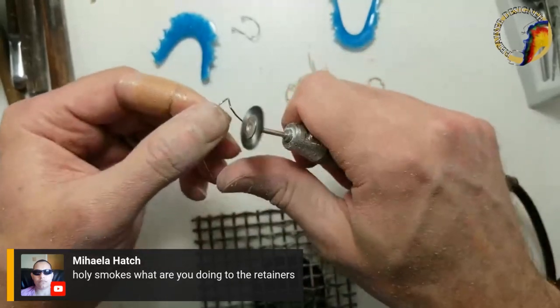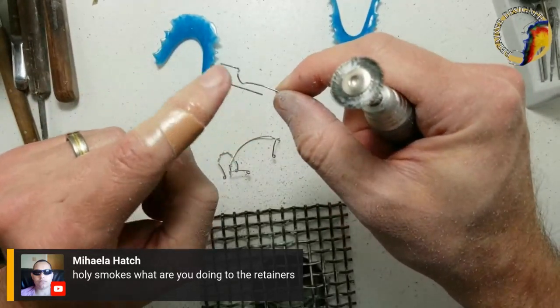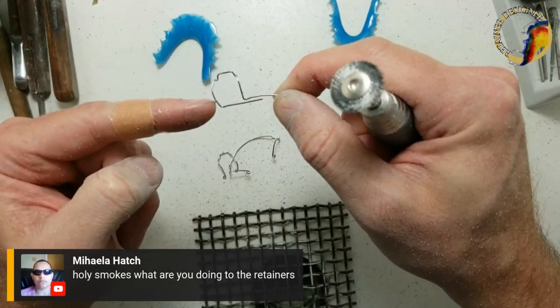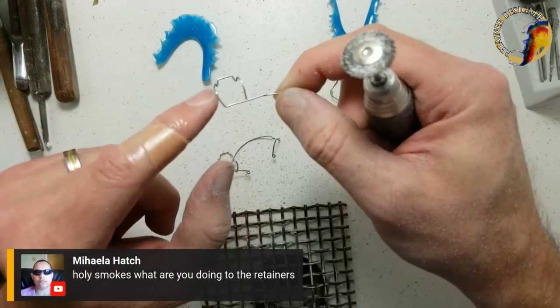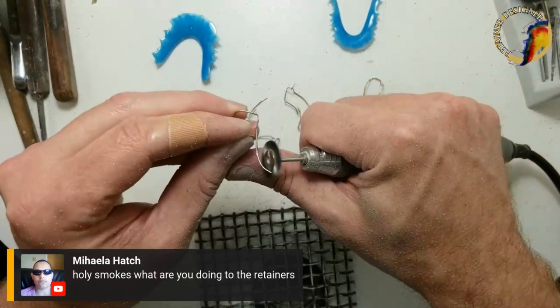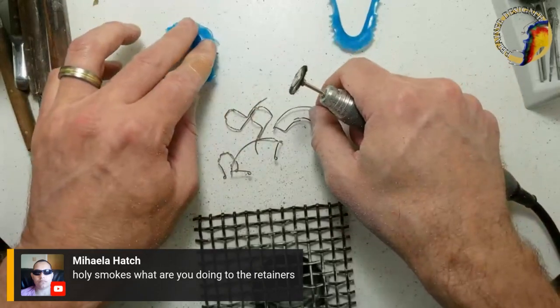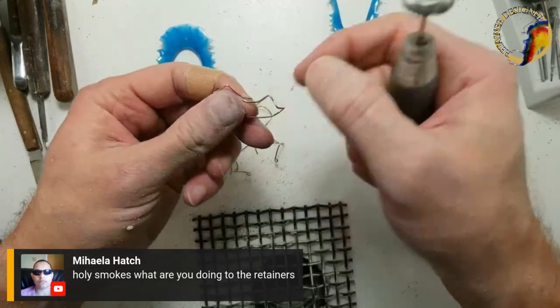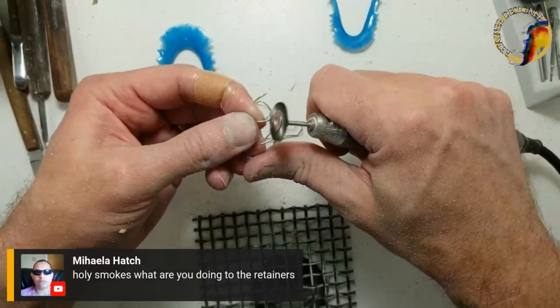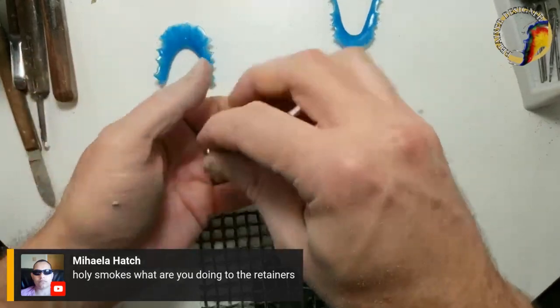No wires were hurt in the filming of this video. I'm just cleaning this up. You can see this is a little off — that's where the Adams clasp was adjusted, which put pressure. When I took it out of the acrylic the pressure got relieved. So if you crank down your labial bow with the acrylic on and remove that wire, it'll spring out because it's no longer under pressure.